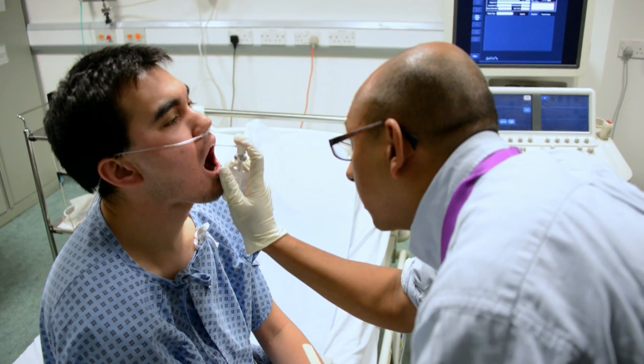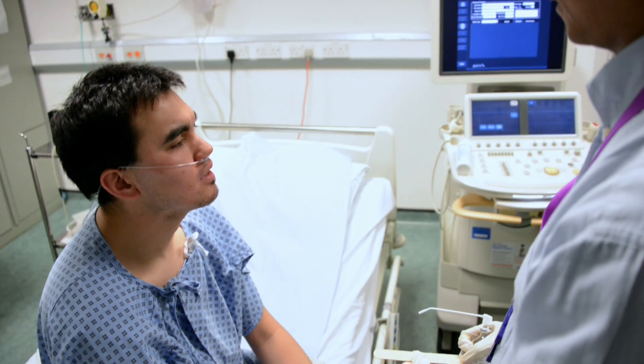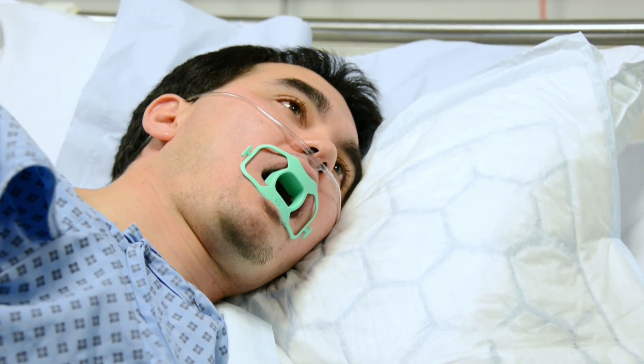We start by giving a local anaesthetic spray, which the patient does find a bit uncomfortable. After this we do give an injection of a sedative to calm the patient down and to make them feel a bit more sleepy.